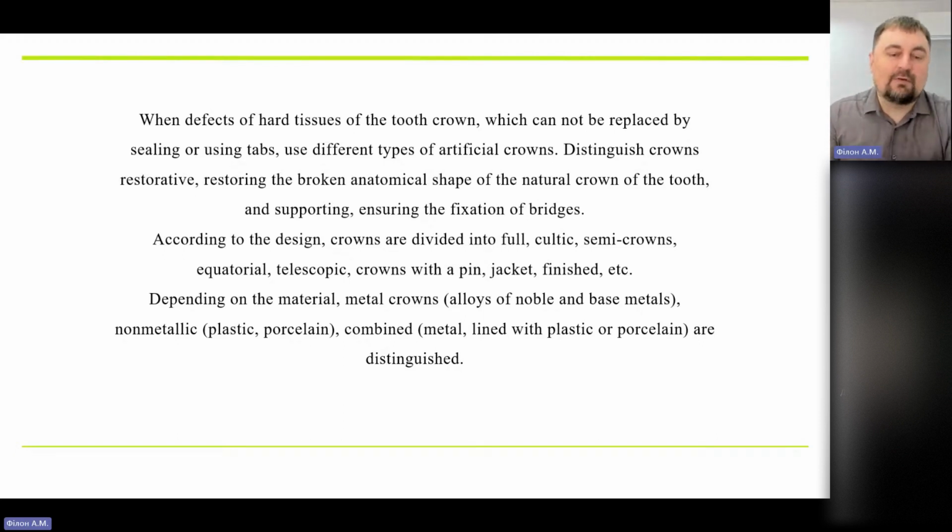But if the break line of the tooth is higher than the gum, yes, higher, then saliva and blood are not going to be a problem for us. We can place a coffer dam or rubber dam there to close the defect and work directly with it, by placing composites and later gluing composite and later placing a crown on it.